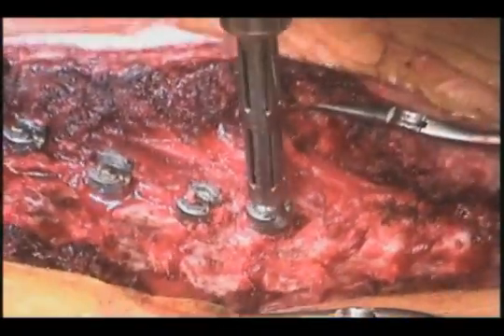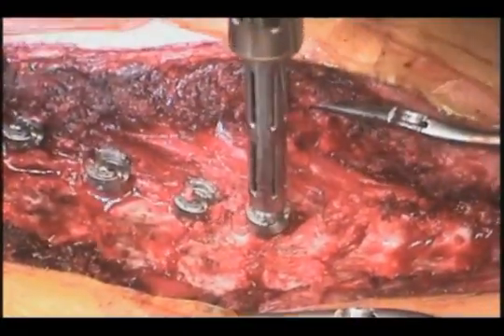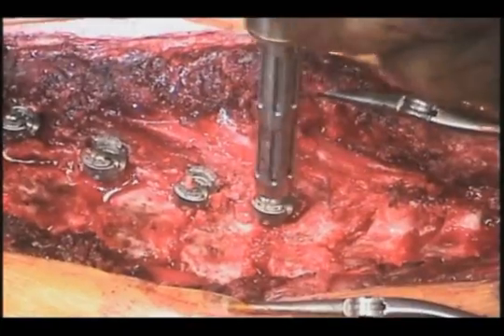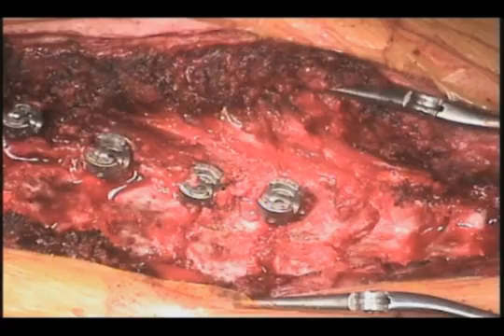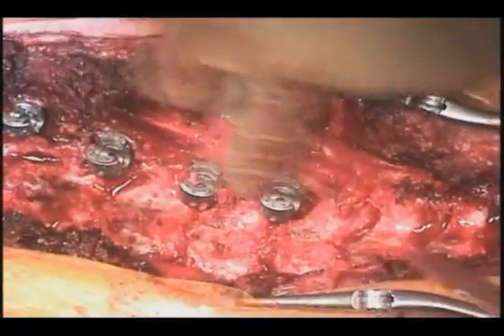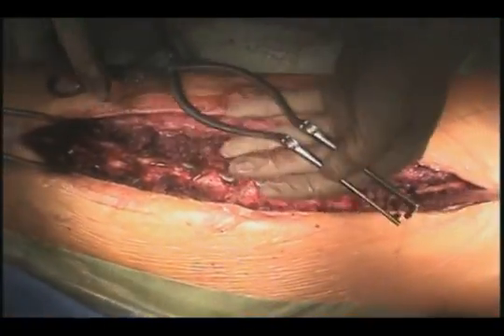And as I drive the screw head down to the spine, you saw that my assistant uses a high-speed burr to burr down the transverse process, or the superficial cortical aspect of the transverse process, so that the head of the screw is not pushed medially, resulting in the tip of the screw coming out laterally. And I can adjust the heads again so that they're harmonious in their alignment and contour. And this will facilitate placement of the rod that we'll place shortly.